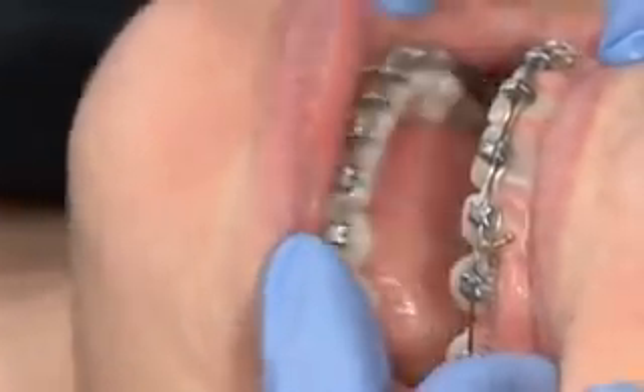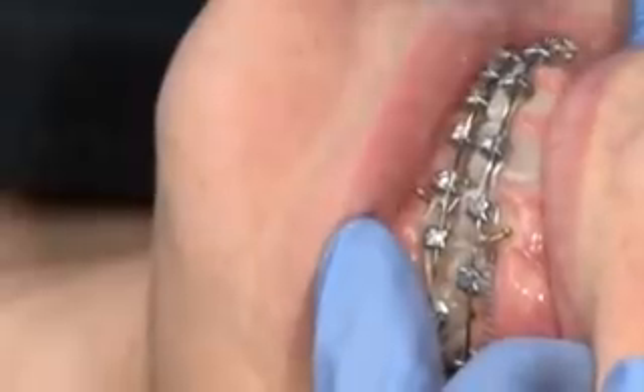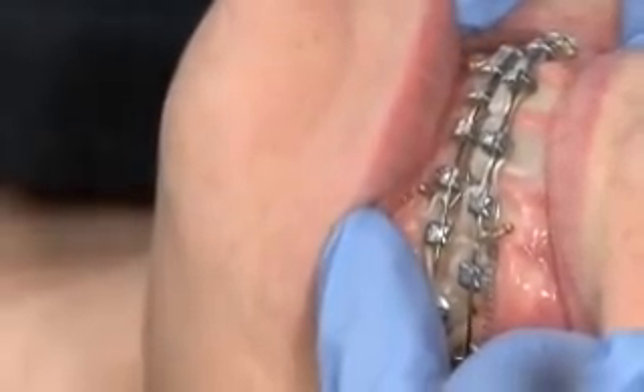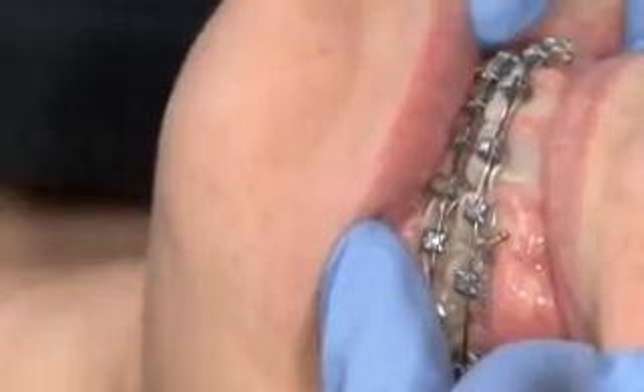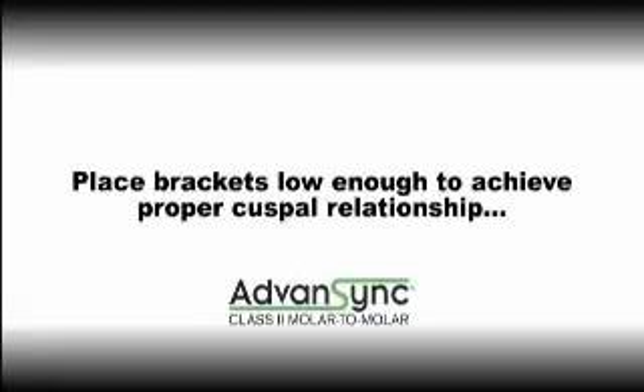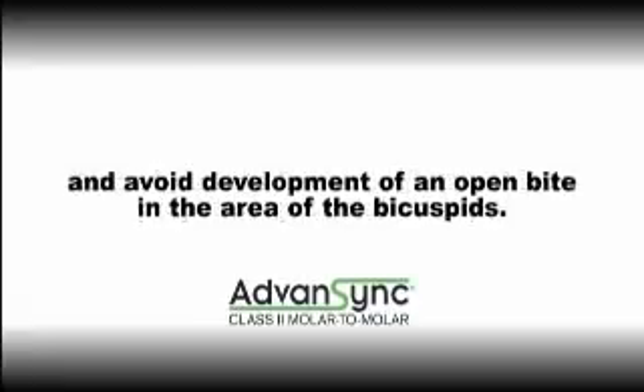Because we want the lower arch level for posterior contact when the M-to-M is removed, watch to make sure that the cusp tips on the lower bicuspids are the same height as the cusp tips on the lower molar crowns. If the brackets are not placed low enough to achieve this cuspal relationship, an open bite can present in the area of the bicuspids.